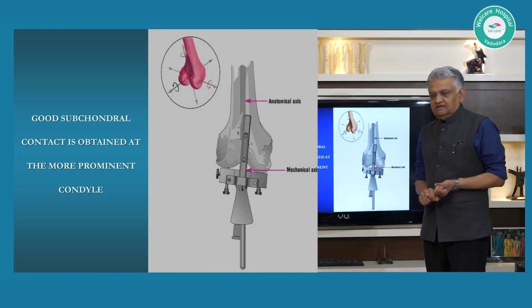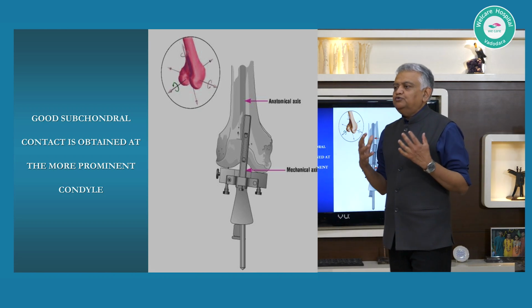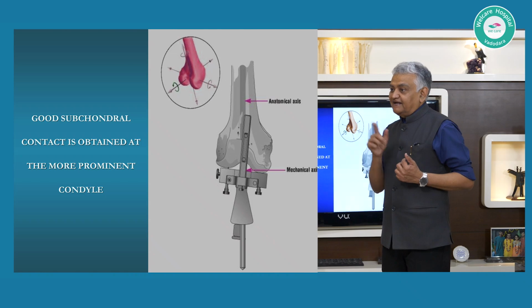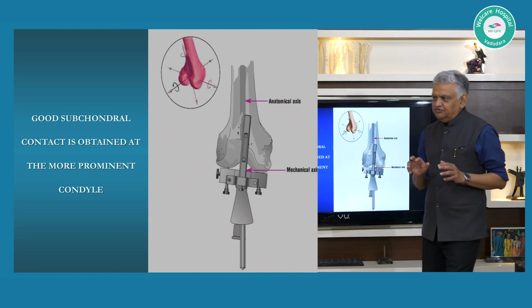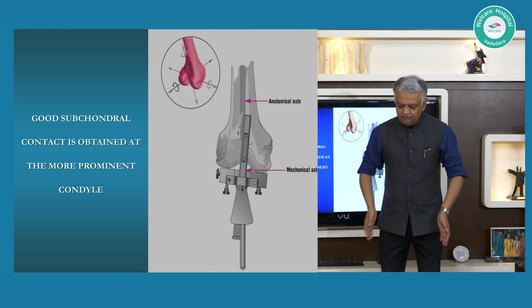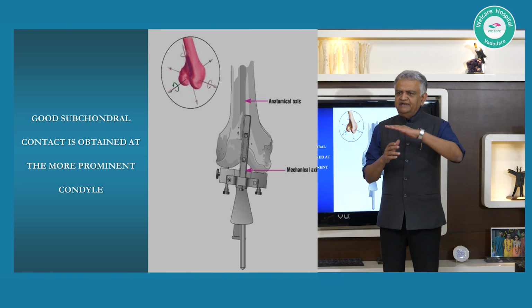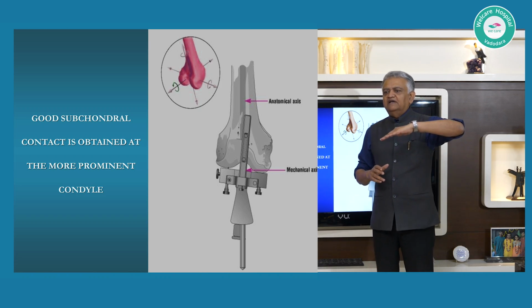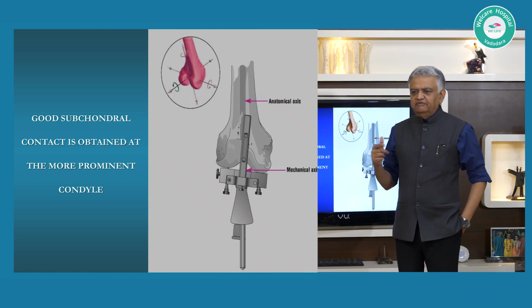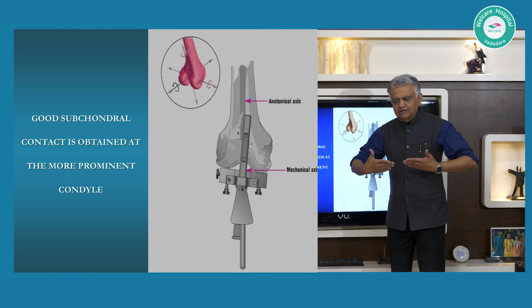What is CPAK as a concept? They brought it to our notice, which intuitively our brains were often not understanding but encountering. So we were getting confused. कि भाई यार ये the limb is in varus, obviously this is varus deformity, but table पे या X-ray में the joint line is looking as if it is in valgus. Now if only we had, maybe when we come to the CPAK, I don't know, disrupt it here, but still.